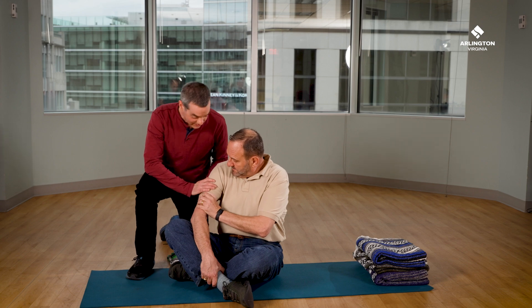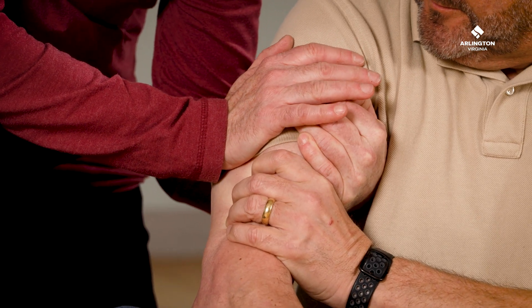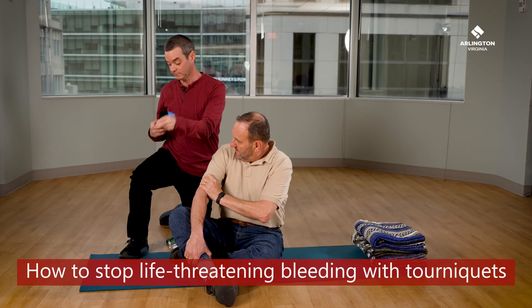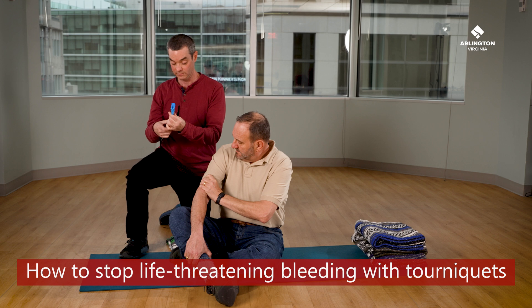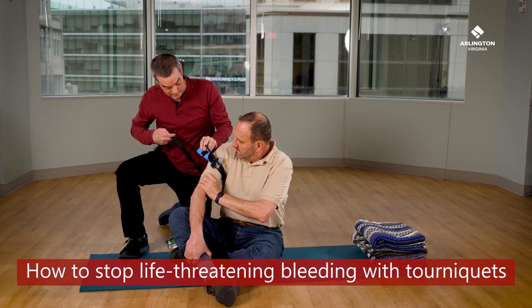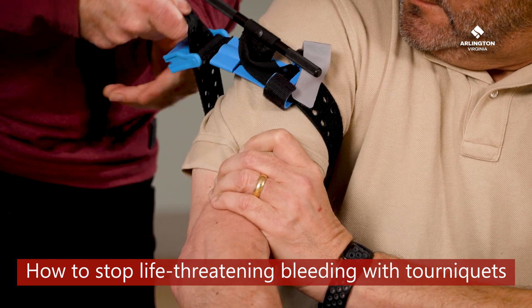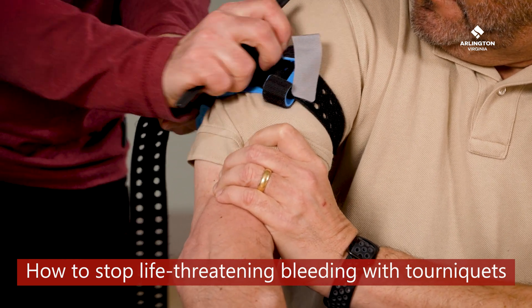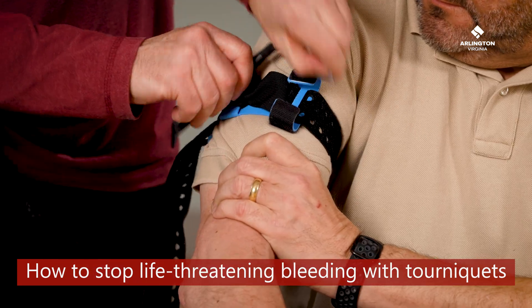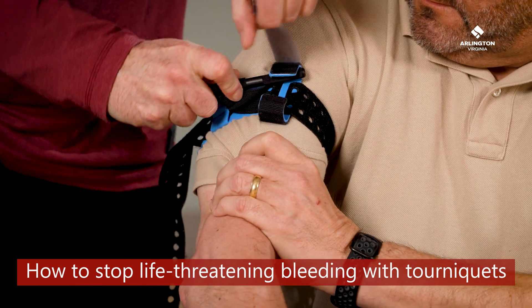The first thing you should do to treat heavy bleeding is apply direct pressure. Once you have slowed the bleeding, you can apply a tourniquet. This is a commercial tourniquet. Commercial tourniquets can be applied in less than a minute and can safely control bleeding for hours. They're often found in trauma kits. Use a tourniquet if there is rapid bleeding from an arm or leg, or if the limb is amputated — even if it's not bleeding heavily — because it will probably bleed later.